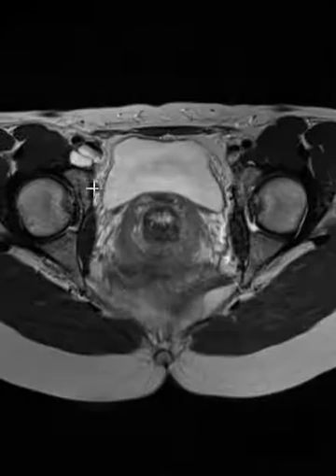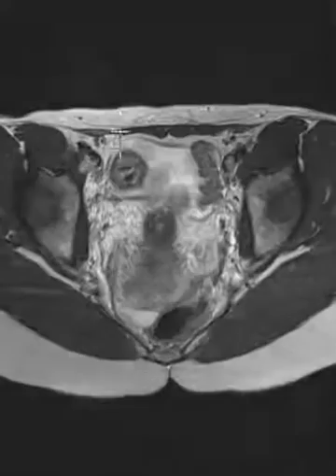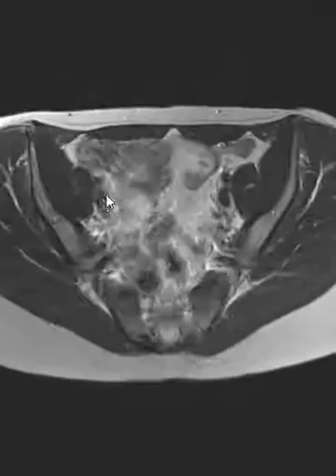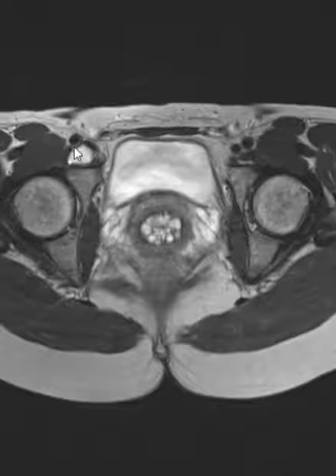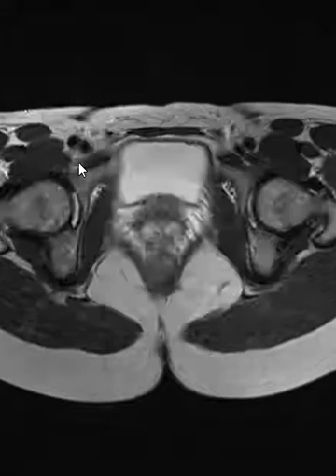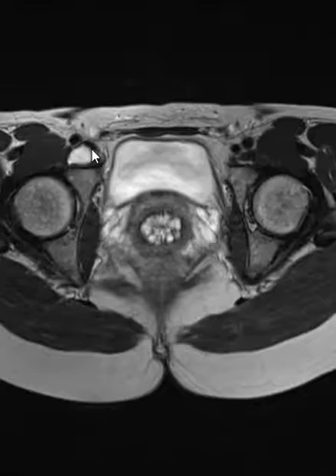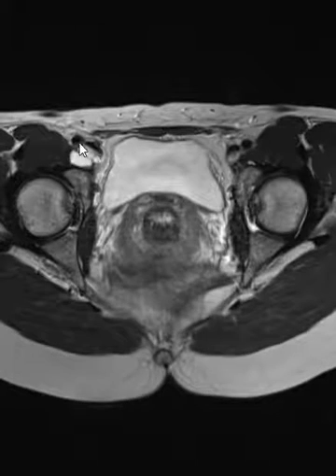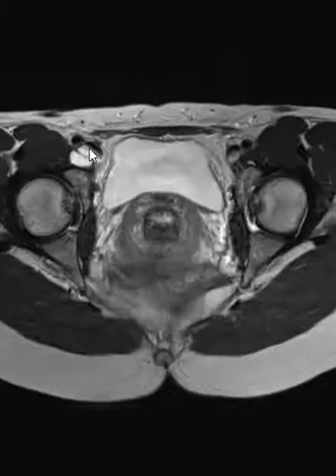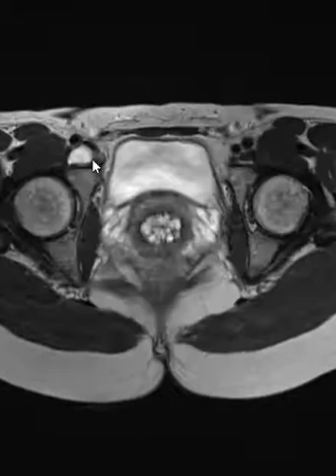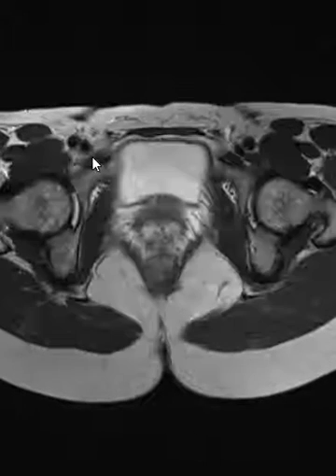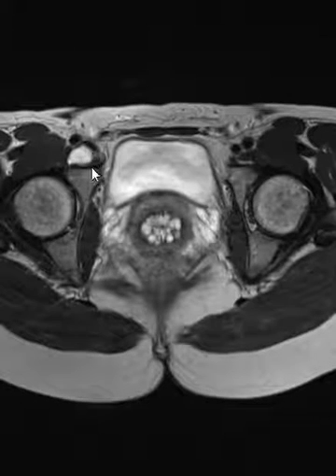there's a little septated fluid collection. We can see the artery and vein here — femoral artery and vein right over here. You can see the artery out lateral, vein medial, and you can see this fluid collection looks like it pushes the vein anteriorly. It does touch the artery, but really here it looks like it flattens the vein, and on this one view right there, it looks like it almost comes out of the back of the vein.